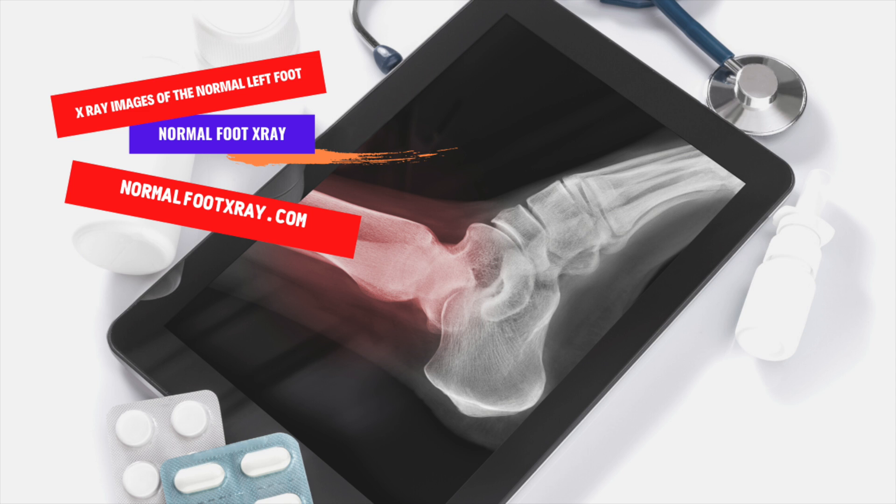An X-ray image of the normal left foot can be a helpful diagnostic tool. Unlike a regular X-ray, an oblique view allows the doctor to more easily view the phalanges and the interphalangeal joint. The base of the fifth metatarsal, as well as the medial margins of the tarsal bone and the corresponding metatarsal, should be checked for alignment and length. The calcaneum and the lateral tendons are also examined.